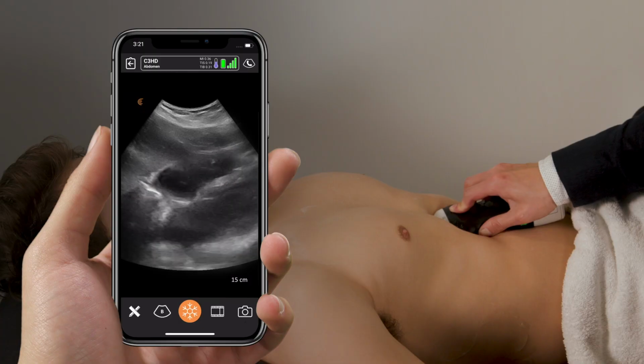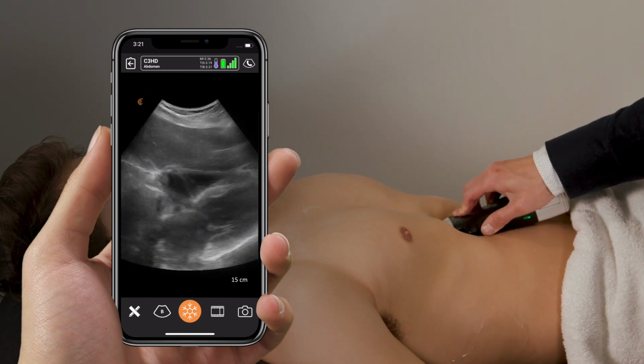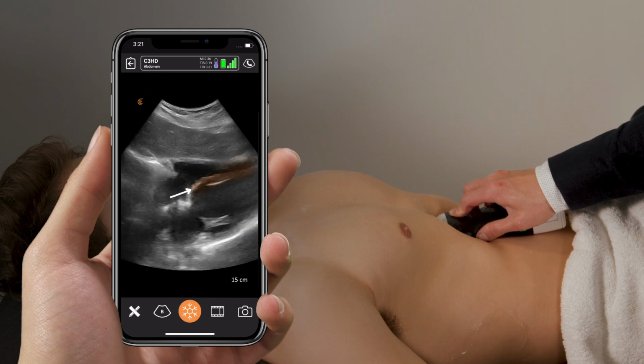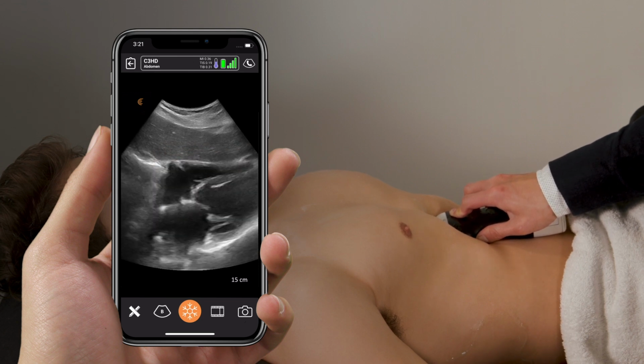Then move on to look at the heart. So here we're taking a subxiphoid approach to the heart. We're in the epigastrium, we're aiming the probe up towards the left chest, and we are aiming to visualize the septum, which is the bright white line in between the two ventricles, as well as the right heart border.